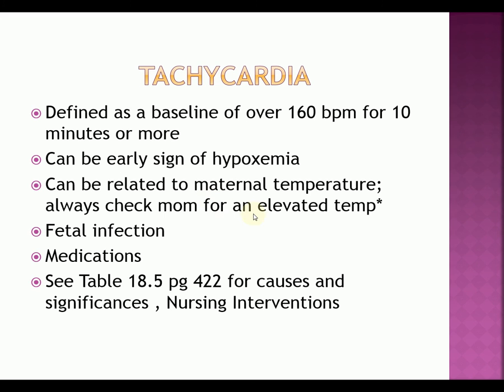Okay. Tachycardia. This is when your fetal heart rate is higher than your baseline of 160 beats per minute for at least 10 minutes or more. So if you had an acceleration that occurred for less than 10 minutes, that was 180 beats per minute, that's not tachycardia. But should that acceleration rise from 160 to 180 and stay there for over 10 minutes, you've had a change in baseline and it's become tachycardia baseline.